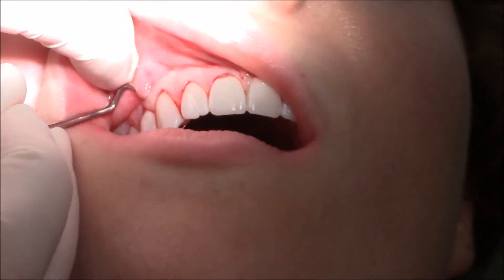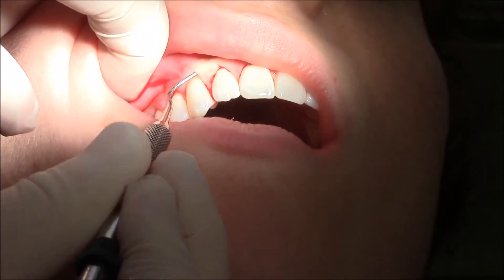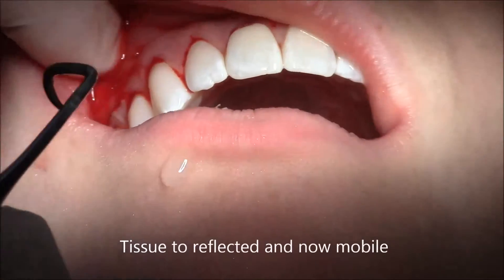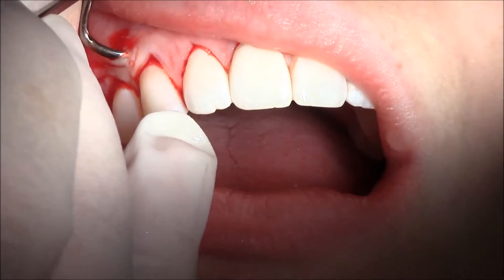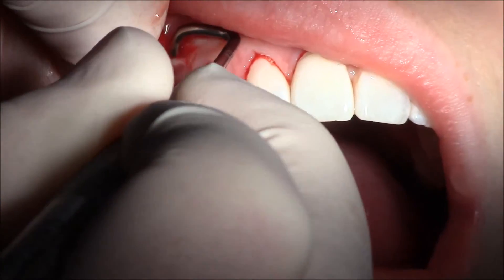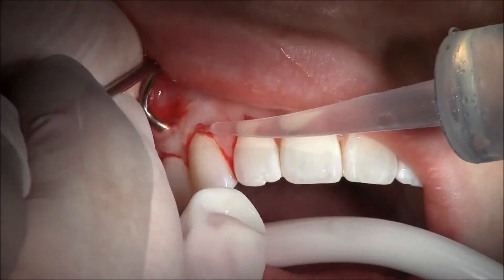I'm going to go back in with our modified instruments. We have the tissue now loose and it's coming down beautifully, but it wouldn't stay there unless we did something to make it stay. There's lots of attached tissue being brought down now on top of that root. These root surfaces are often very sensitive until you've had this procedure done. Again rinsing with sterile saline, making sure that we keep everything very clean. We have the root structure totally covered now by the attached tissue.